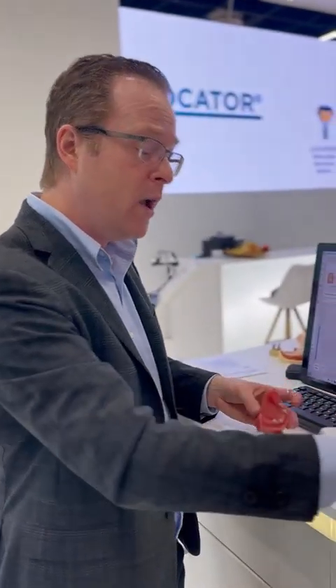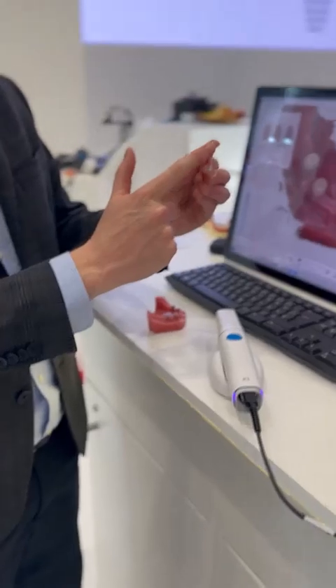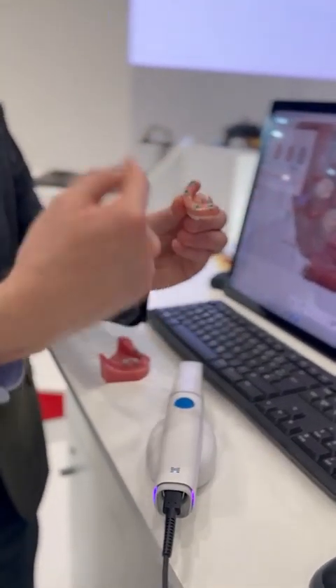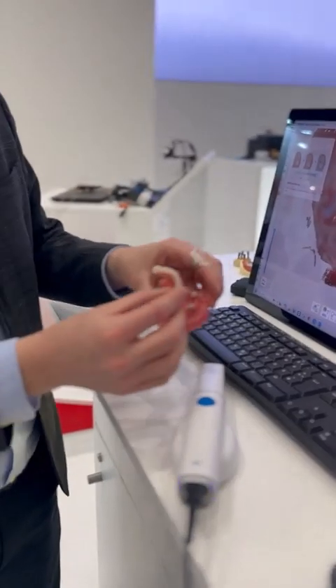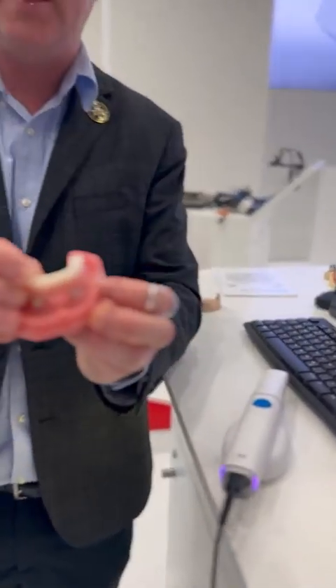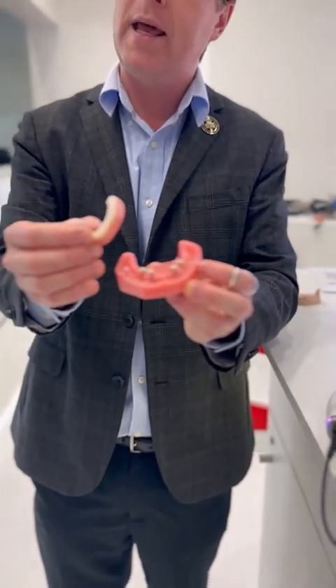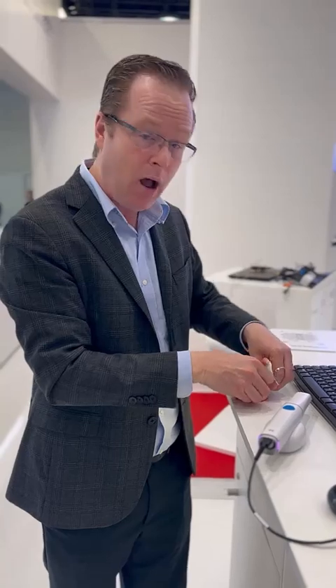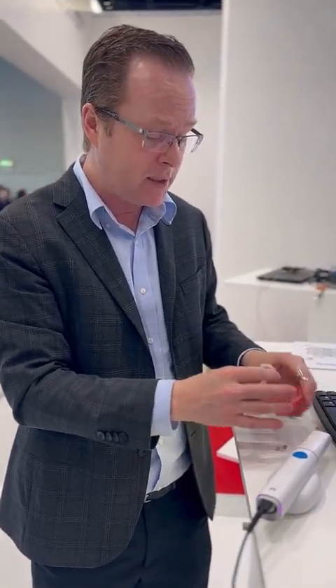If I wanted to, I could also do a pre-preparation mode — just add the scan flag in with the Medit, scan my prosthesis 360 degrees as well, join that to the scan virtually in the software or in the Medit software. Now I can bridge together the scan of the scan bodies plus the scan of the prosthesis to give my laboratory where we set the teeth.